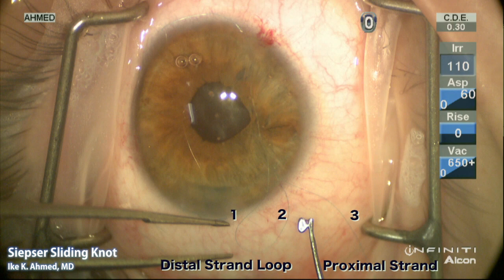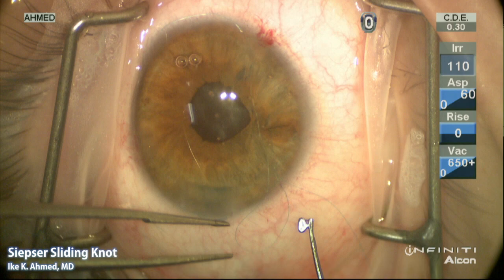Suture number one is passed through the distal paracentesis all the way through the eye and emerges through the proximal paracentesis — it is not engaging the iris. Strand number two is part of the distal strand and goes from the iris through the paracentesis visible on the conjunctiva. The third suture, the proximal strand, goes from the iris through the paracentesis on the proximal side. It's important to have these three suture threads oriented correctly as shown in subsequent steps.